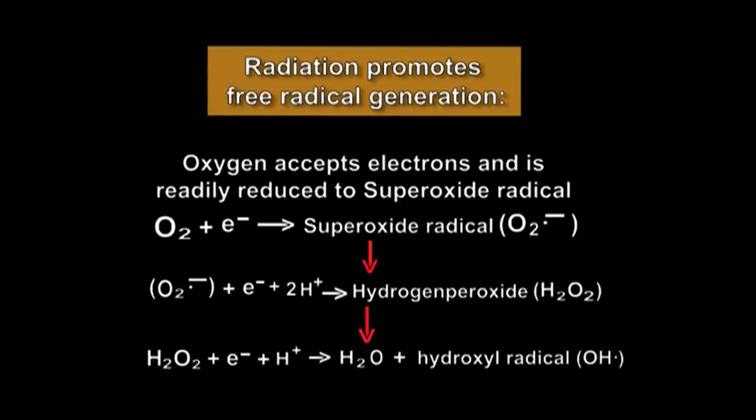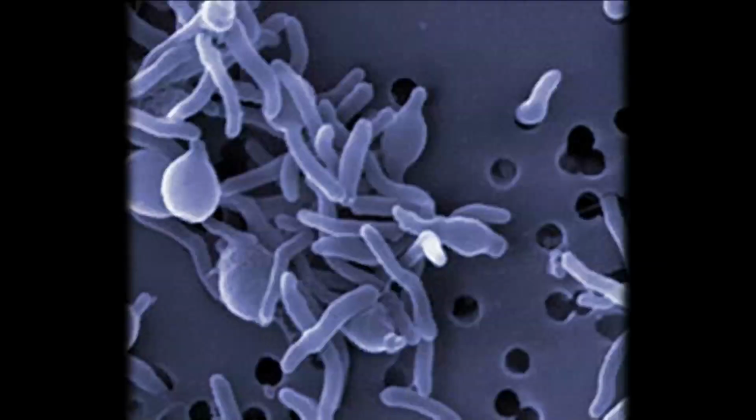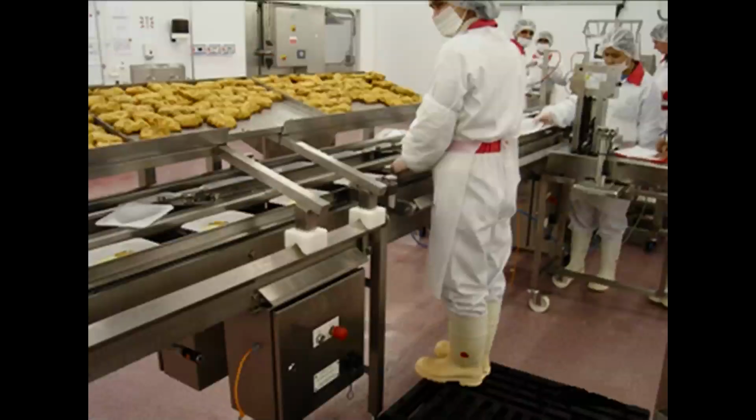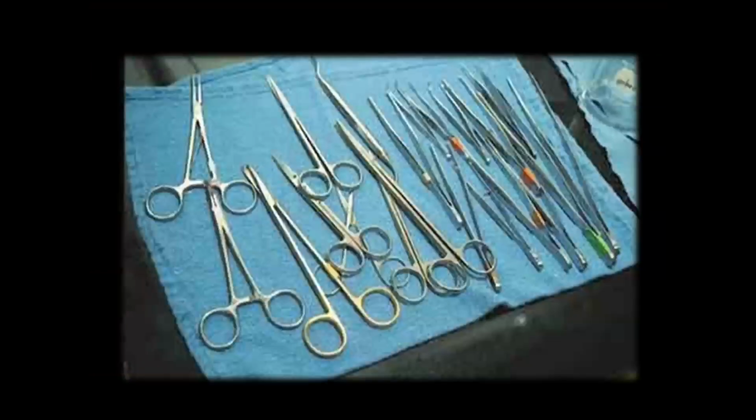This leads to disruption of the important macromolecules. These radicals not only destroy proteins, they destroy the nucleic acids. So all the vital macromolecules of the microbes are getting disrupted. This is the mode of action of ionizing radiation. These are used for sterilization in the food processing industries, and in those places wherein UV rays cannot penetrate. They are utilized for sterilizing disposable petri dishes and surgical equipment.